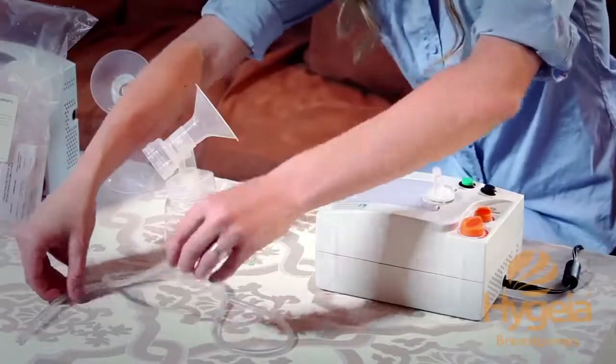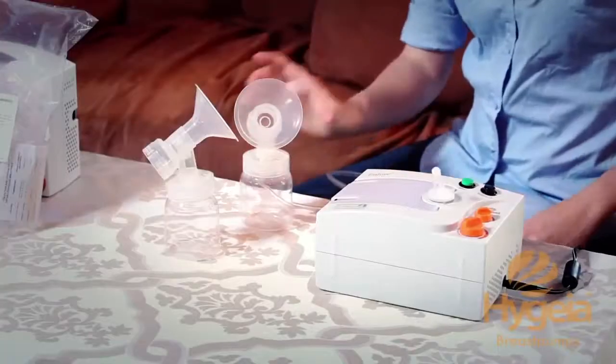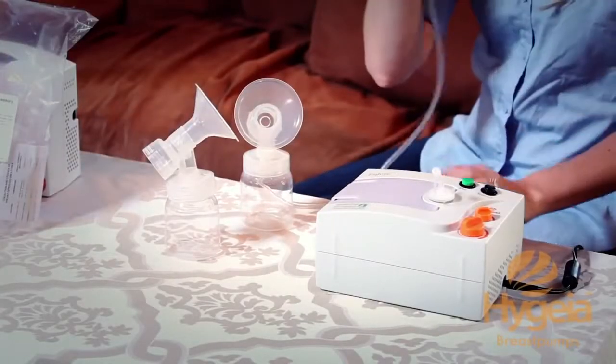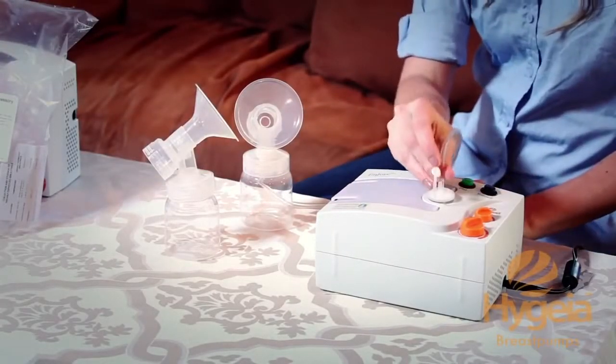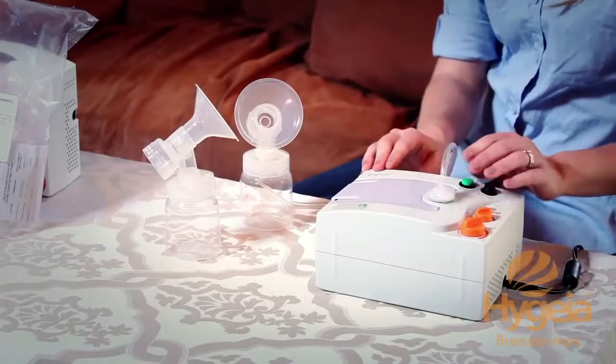Next, take the tubing and plug the orange end into the flanges. Make sure it fits tightly. Now take the other end of the tubing and plug it into the filter. If you want to single pump, only plug in one tube and then use the cap to seal off the other stem on the filter. Now we are ready to pump.